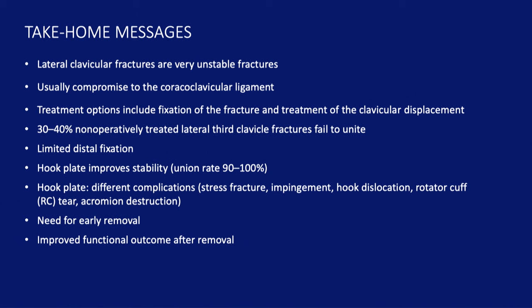This treatment option includes the fixation of the fracture and treatment of clavicular displacement. 30 to 40% of non-operatively treated fractures fail to unite. It has a limited distal fixation. Hook plate improves the stability in this region and you can get a union rate of about 90 to 100%, but it has its own complications and it needs removal.